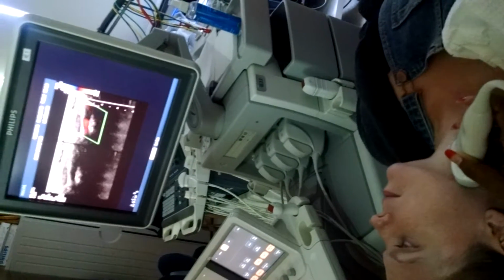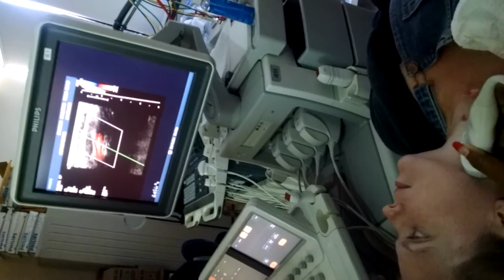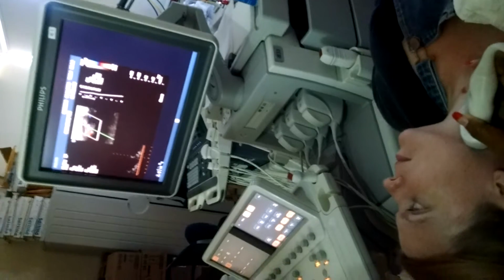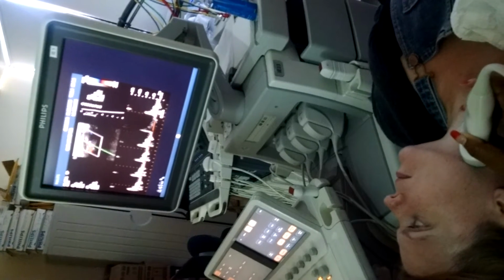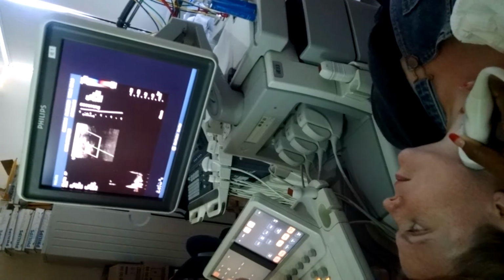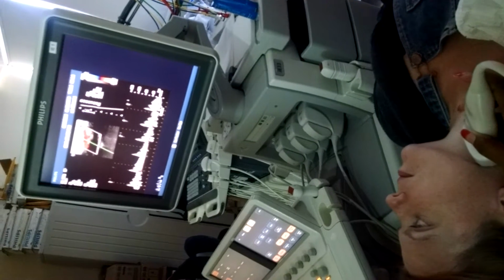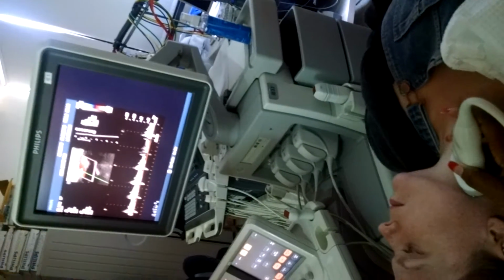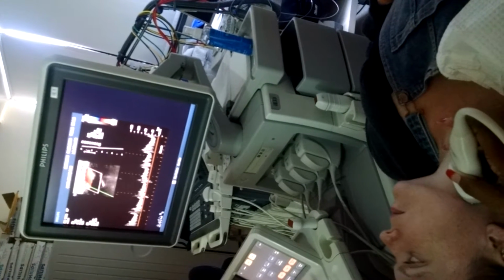See the difference? Yeah. So if I put on spectral, update choice. I don't think this knows to go in. See how that's frozen? That's what I was talking about with the update, so I could do simultaneous. And I have real-time B mode, so you make sure you're still in the right position. And then if I rotate, now I'm in the ICA. And it's a different sound and a different waveform. So that's ICA.